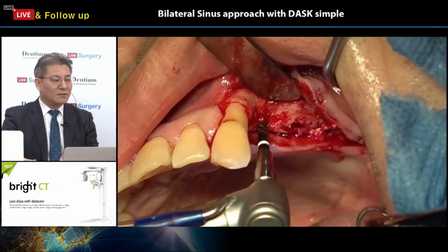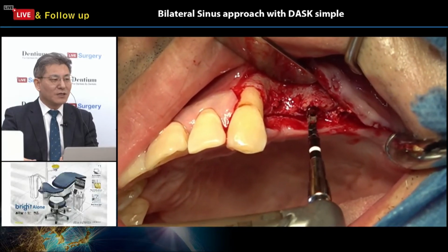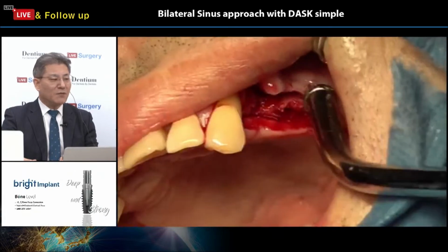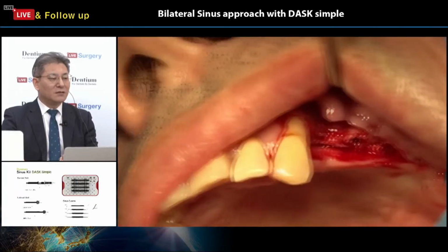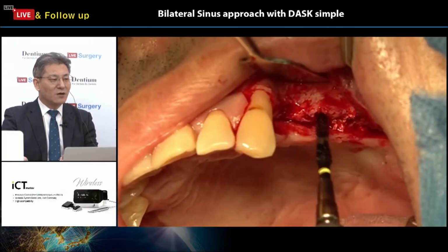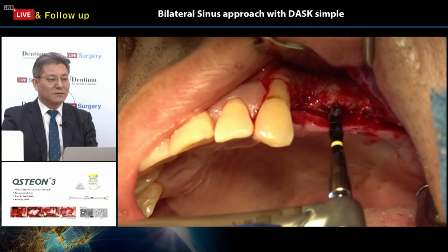Okay, after the sinus crestal approach and the final drilling here, yeah, he got almost 9 millimeter. He is preparing the 9 millimeter length of TL, the bright implant.